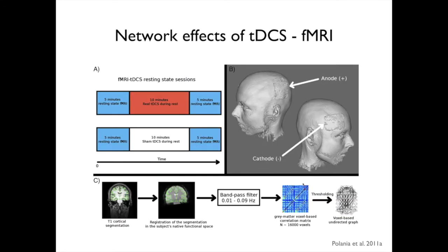And what we could also show is that tDCS induces network effects. And that's also important for the mechanisms of action of the stimulation technique. Rafael Polanyi, I want to show you two studies he conducted a few years ago. Here the fMRI study, where he did first resting state MRI, then 10 minutes real or sham tDCS, and then again 5 minutes resting state MRI to look for network effects of tDCS.